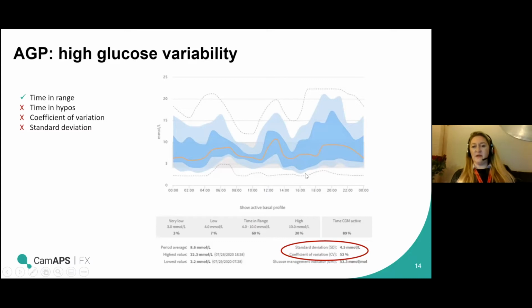It could be something to do with the fact that there looks to be a bigger spike post lunch that may then be impacting later on in the afternoon. And again, overnight potentially there's a little bit more. If you look from midnight through to 4 a.m., you can see there's an increased area where there's glucose levels below the target range. So those are the things initially you want to pick out. And also around mid-morning, on this particular person's graph, there's much less variability. The lines are quite tight from 8 to just before lunch.